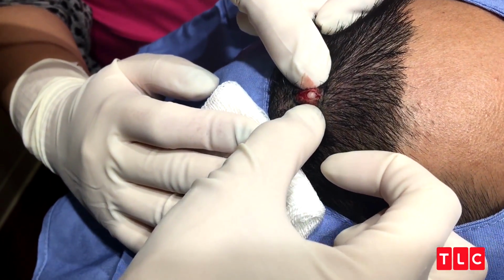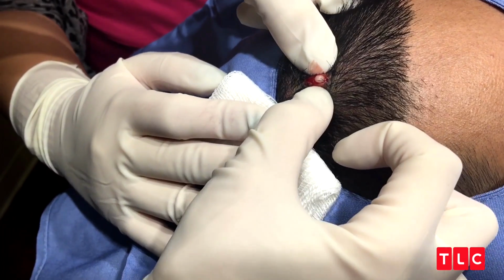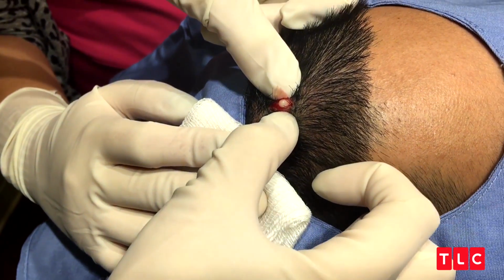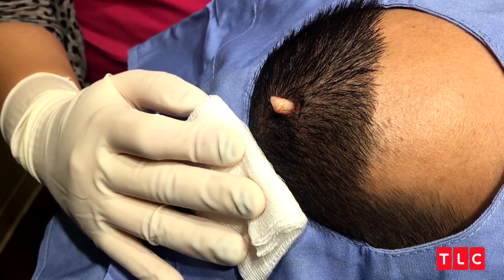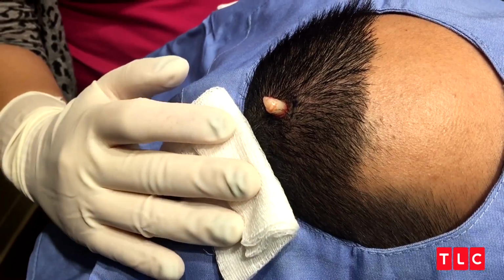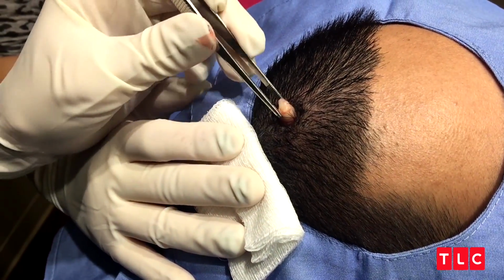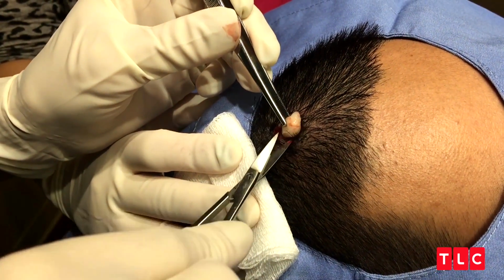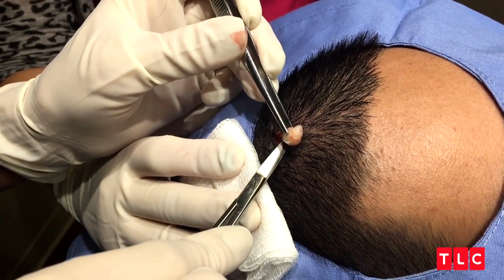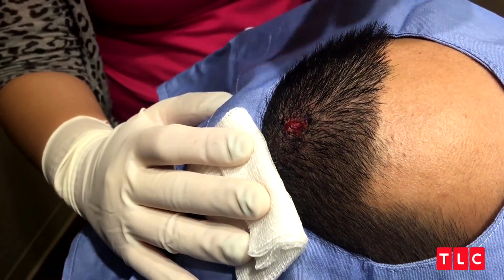But it wasn't a little circle. Usually they look more like an olive or just like a garbanzo bean. In this case, it was literally like a little horn that popped out of his head. So let me pull the rest of it out here. I can see why it was pushing against you. That's why it got a bump on one side.